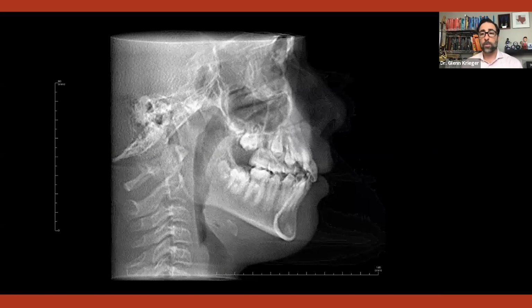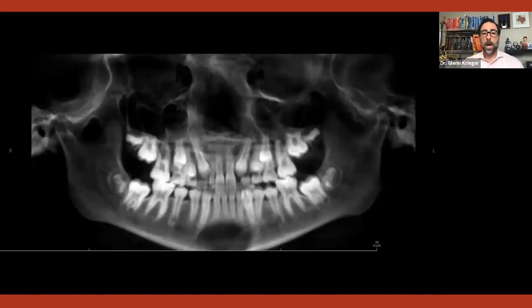So now we're going to go back to what I would have used if I didn't have a CBCT. And again, to me, it's a totally different ballgame. There's so much more information. Now, you could make the argument, I can take a PA ceph, I can take an off-angle occlusal. You can do those things. But to me, that's kind of like a workaround. It's like if I have a car and it's raining, why would I take a motorcycle to get to the store? Could I do special jerry-rigging stuff to make it work? I could. But at the end of the day, I can tell you this patient will get a better diagnosis and arguably a better treatment plan and certainly better tracking as I take other radiographs and a better explanation to mom and dad than I could with any lateral ceph or panoramic film.